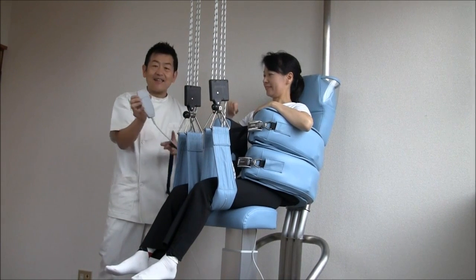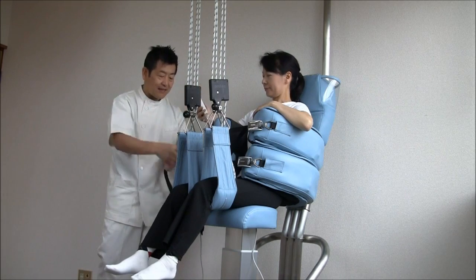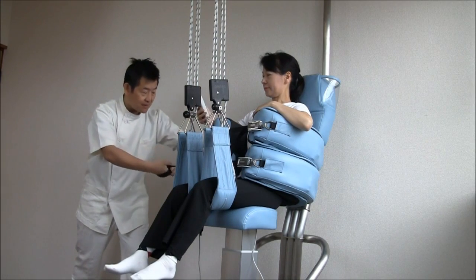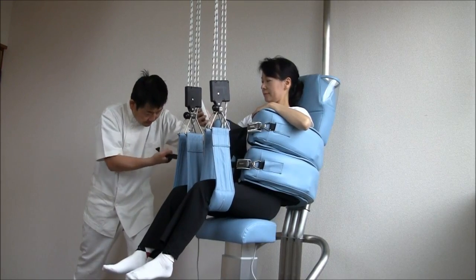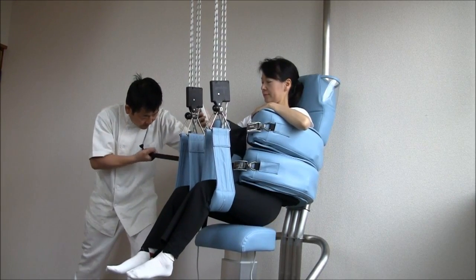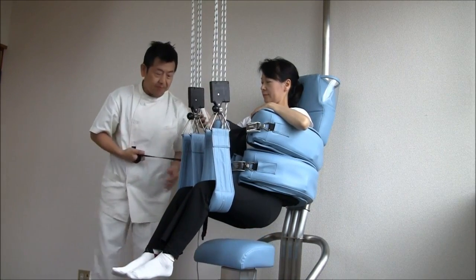Chapter 3. Tightening the cushion harder. The lower arm cushion must be tightened securely. Ask the patient if it is too tight and adjust accordingly.